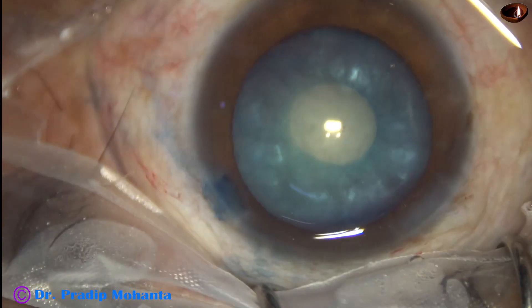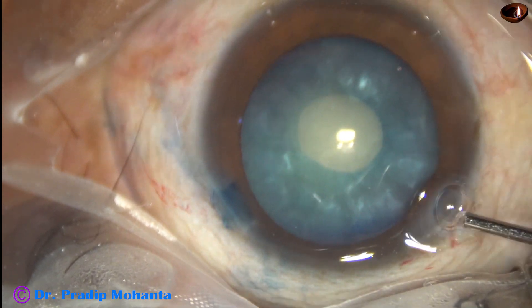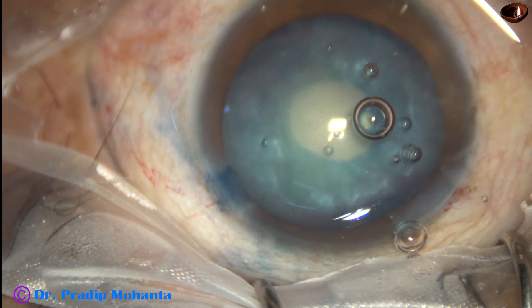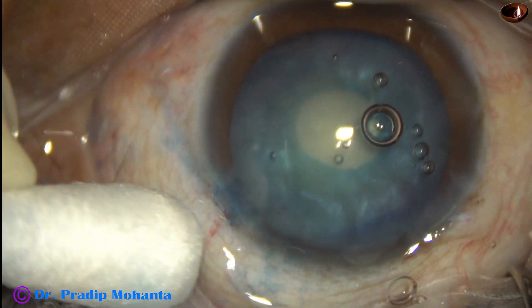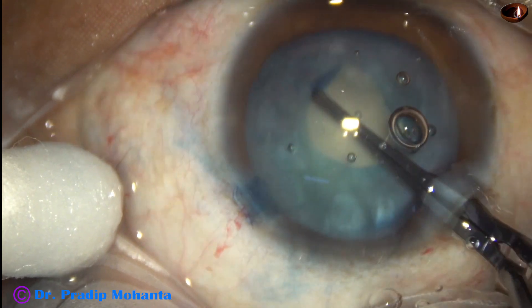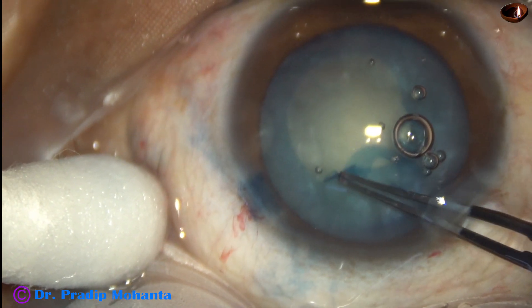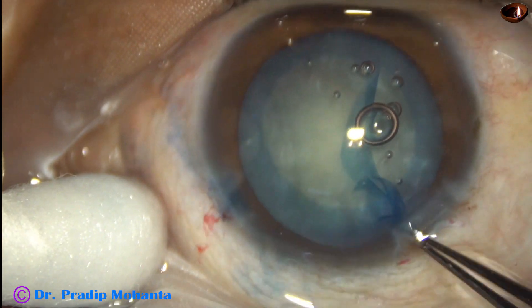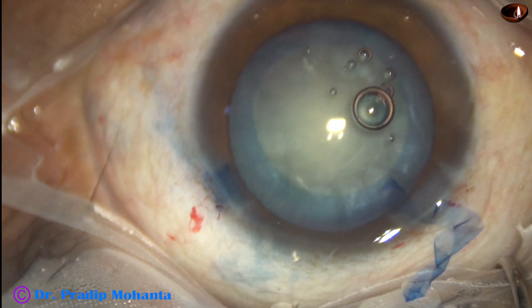There is some elevation at 2 o'clock near the side port. I will be careful not to release the rhexis at this point. While injecting visco, an air bubble was there. New surgeons should inject some visco and remove it so that you can see better. To save time, I did this — in spite of the air bubble being there, I tried the rhexis. But young surgeons should not consider this; you can have enough time for a case.